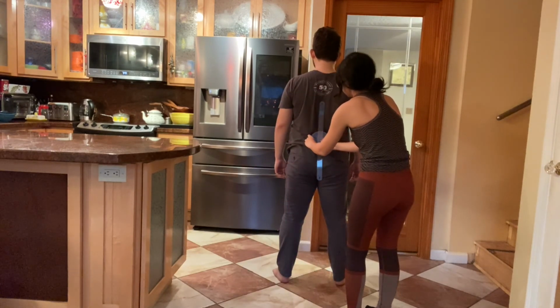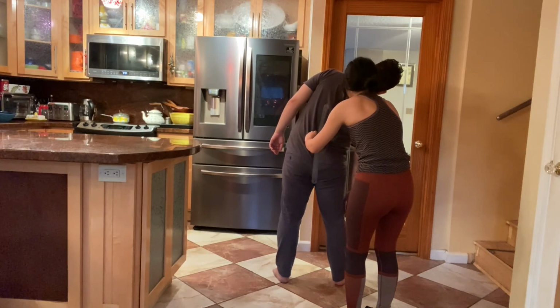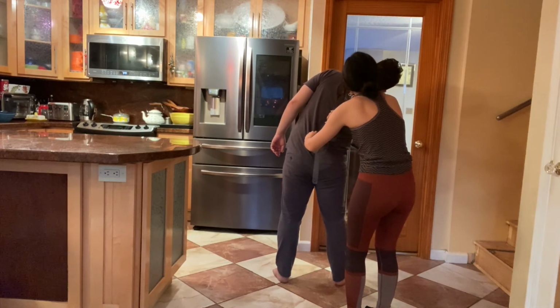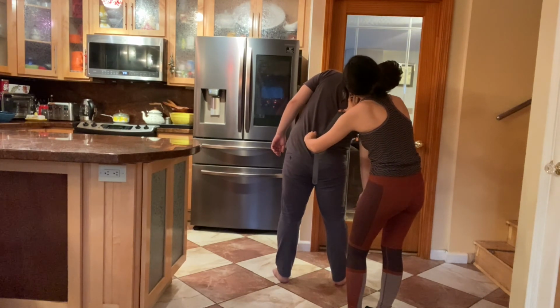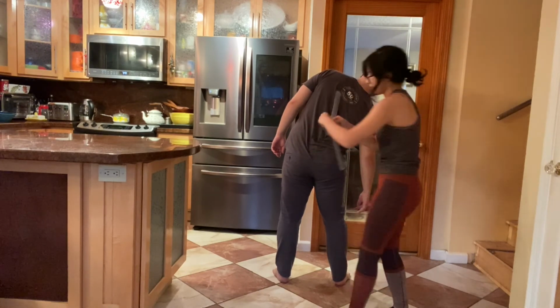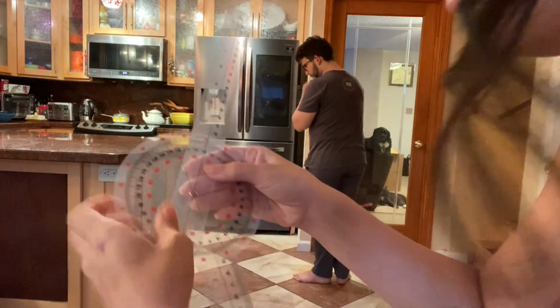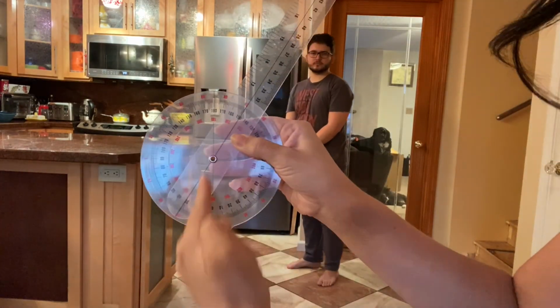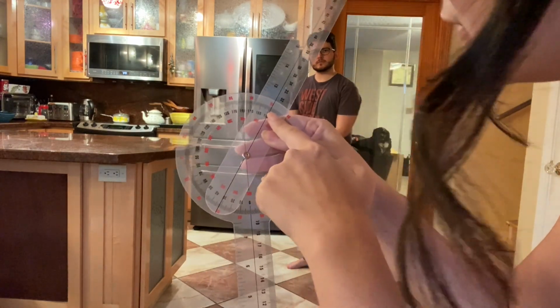Go ahead and flex. Right, and relax. Okay. And as we can see, it's starting at 180. The goniometer is at about 151, meaning we have a reading of 31 degrees.